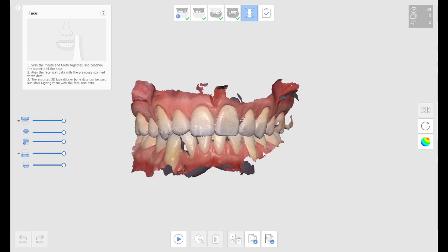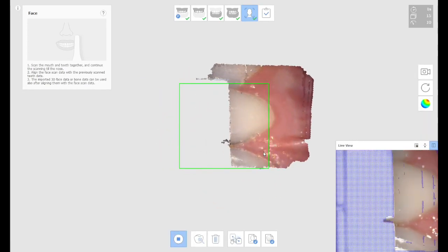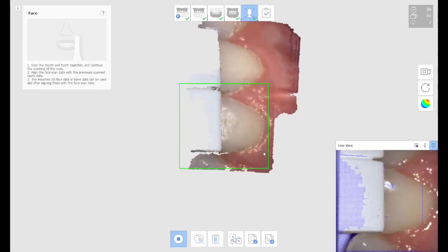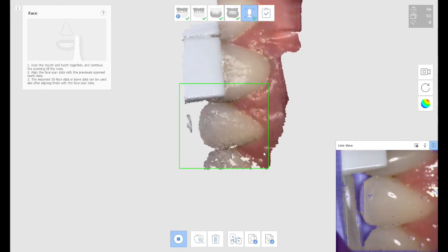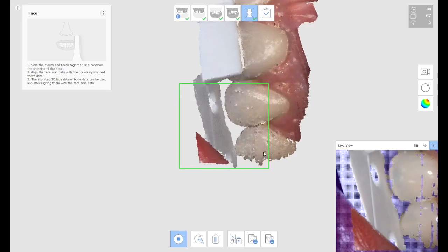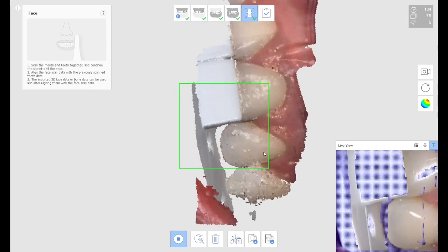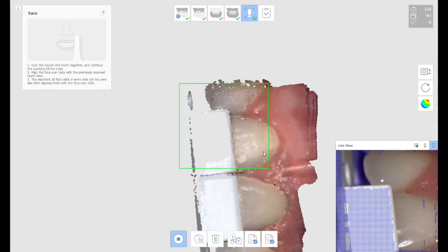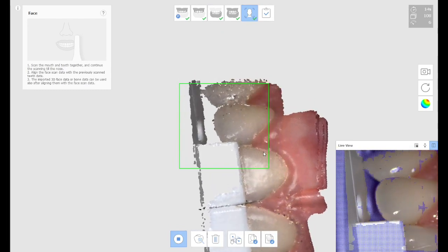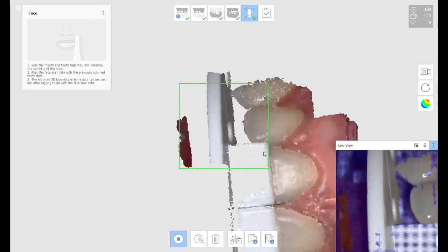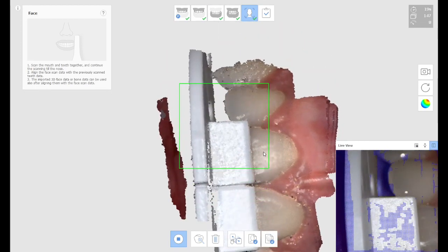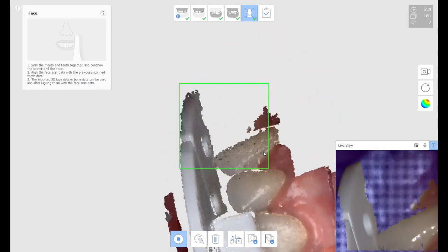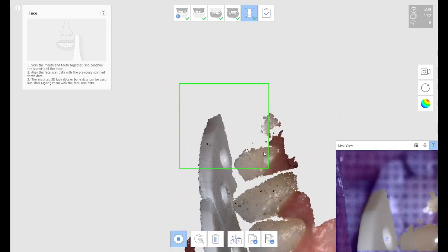What you do is we're going to start by scanning the maxilla with the index tray that comes with the AD2 system. You can also use the Coise from Panident, the Coise system, put in the patient's mouth. You can use a bite registration material as well. In this case, I'm not using it because I'm scanning myself.